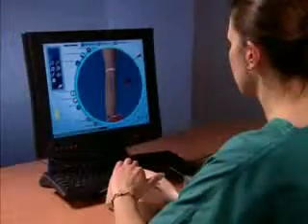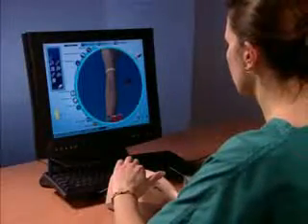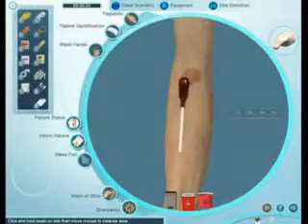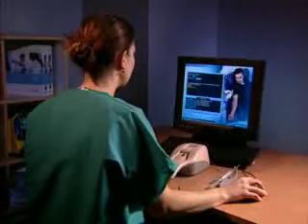Virtual patients respond with physiological reactions based on your interaction with virtual anatomy, virtual equipment, and the specific case scenario.